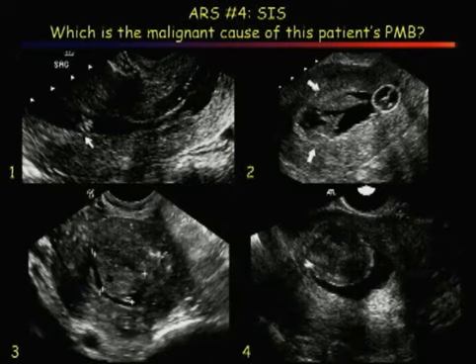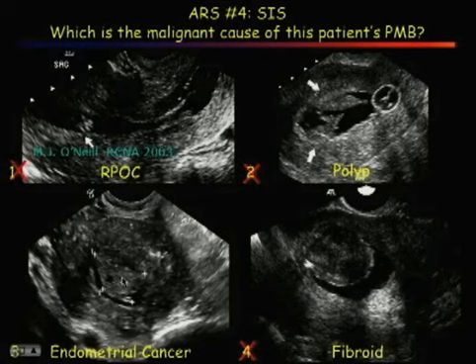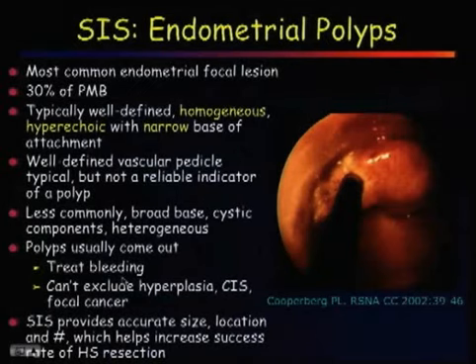So which of these 4 patients has a malignant cause for postmenopausal bleeding? We see bumps in all of them, but this turns out to be retained products of conception from MJ's article. Here's a bunch of polyps. Here is a fibroid, and this is the endometrial cancer right here. So we're pretty good at making path diagnosis, but not good enough.